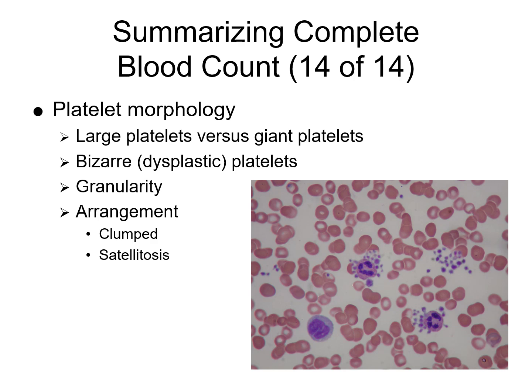That's platelets surrounding neutrophils. This happens in some patients, it doesn't happen often, but that's what the picture shows down below. You have those little purple dots around the white blood cell. Those are actually the platelets, and that is called satellitosis. This can interfere with automated counts as well, because it's not going to count them appropriately since they're hanging around the white blood cell.